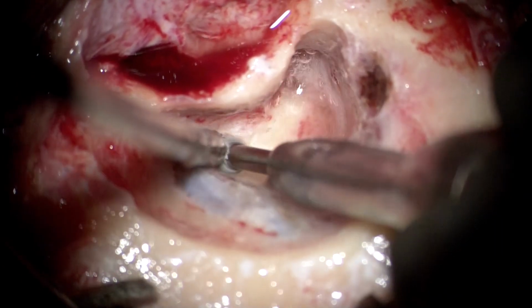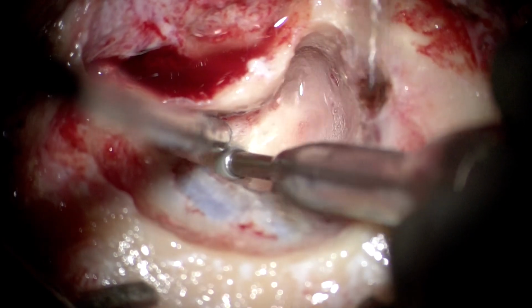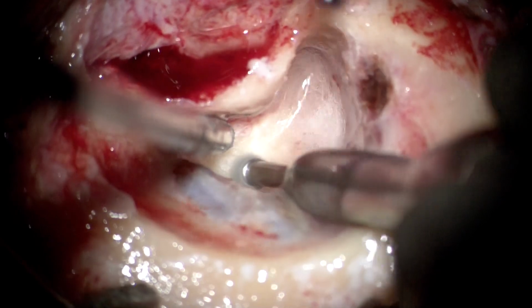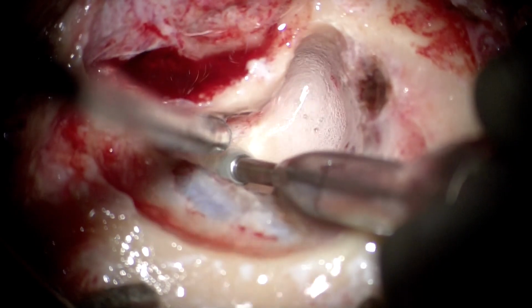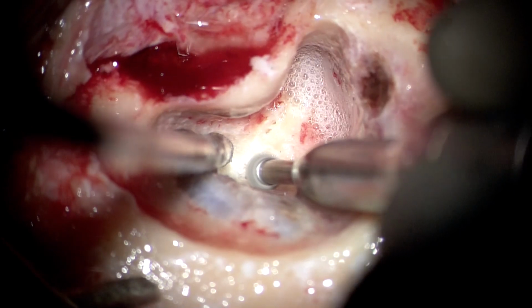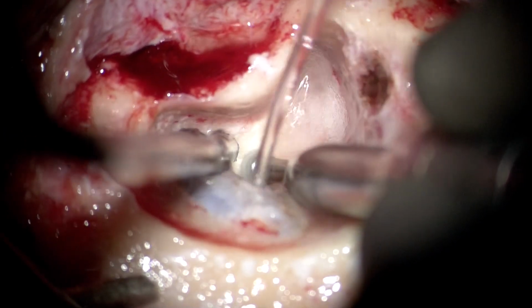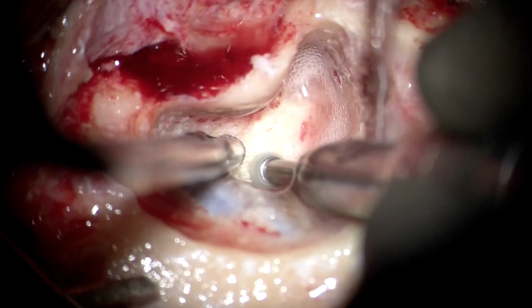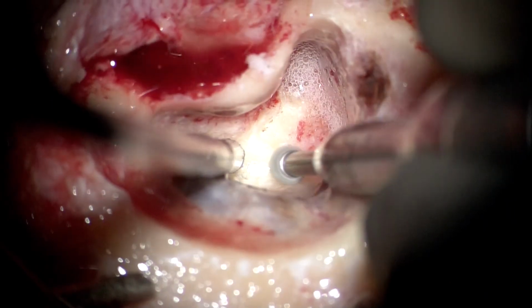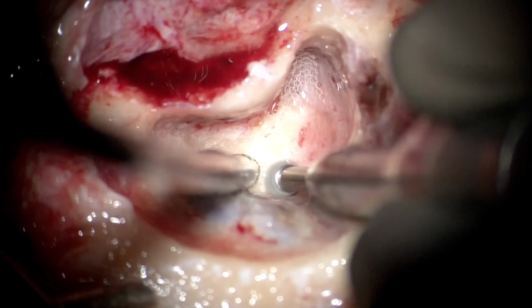You can see here that the lateral canal has been just partially opened, and we are now in the process of defining the posterior canal before we can go up towards the superior canal. Also very important is a continuous ample amount of irrigation from the assistants, to be able to get the bone dust out of the surgical field and not affect your surgical field exposure.